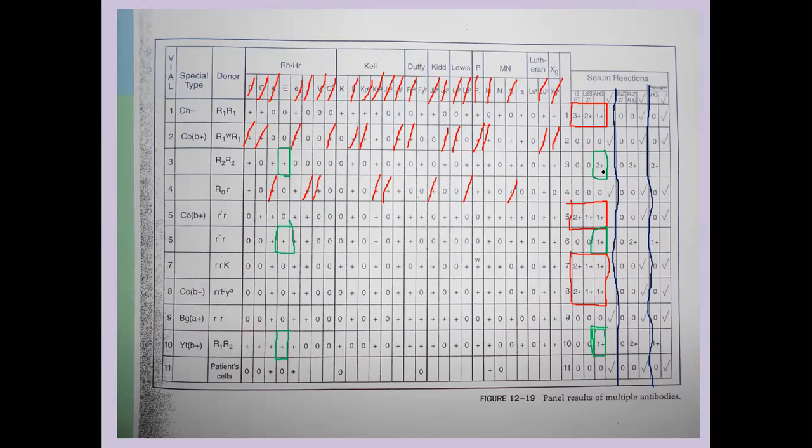So let's take a look at our E antigen with regard to the little e. When we look at cell 3, we see that big E is homozygous in this case. There's no little e. So it's like having a double shot of E antigen there, okay? When we look at cell 6, we see big E is there, but also little e. That's heterozygous.